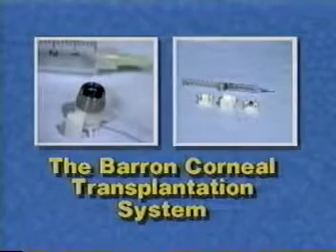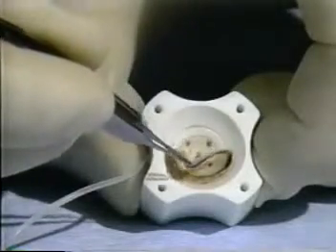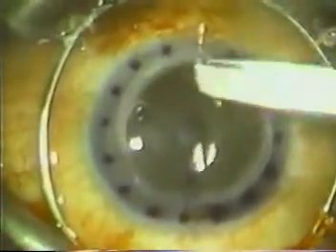The Barron Corneal Transplantation System allows the surgeon to make predictable and regular matching cuts of both the recipient and donor corneas while accurately marking them for even suture placement. Now being used extensively, the Barron system is easy to operate, disposable, and inexpensive.